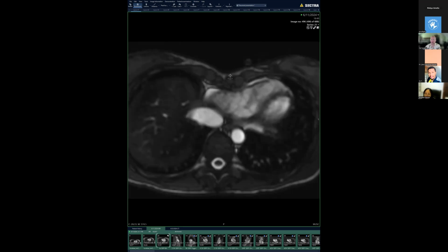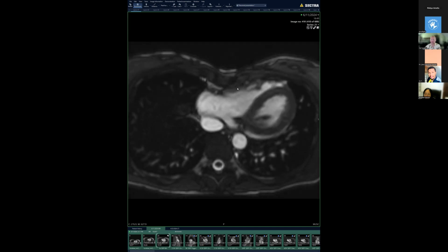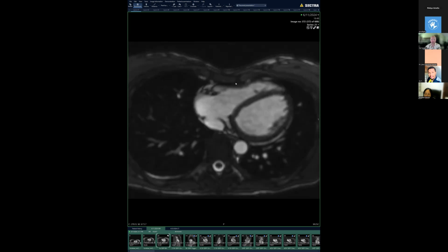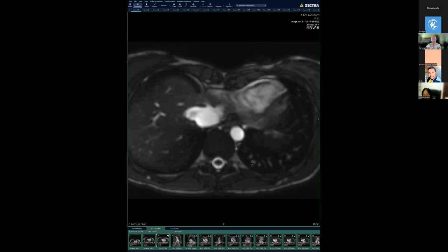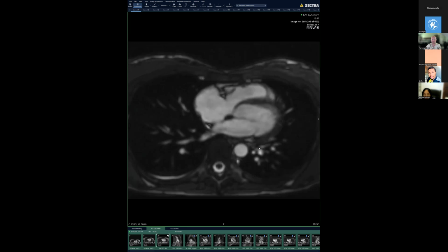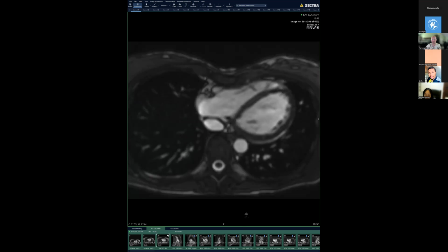So this patient underwent all these kinds of examinations, cardiac catheterizations, right heart catheterizations, and of course, a cardiac MRI as well. The cardiac MRI was actually ordered with the question of, is there pericardial constriction? Because on right heart catheterization, she had all the signs of constrictive pericarditis. And of course, on echo, they didn't see anything wrong with the pericardium, but echo is not the best modality, nor is CT. So they decided to order a cardiac MRI.